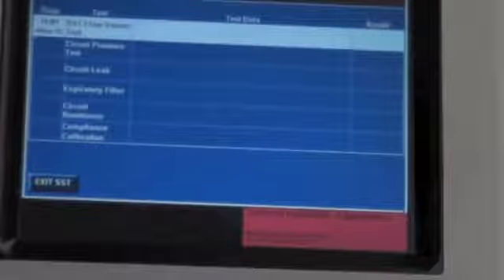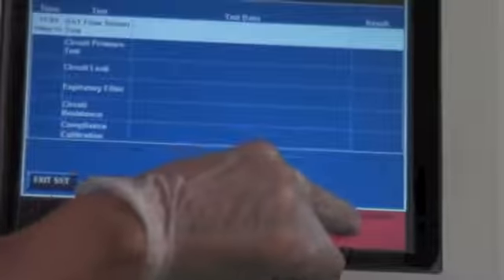If the status of the SST flow sensor test is a failure, you cannot use the override function. You will have to repeat the test. The system checks the accuracy of the inspiratory and expiratory flow sensors. After the test completes, the system prompts you to connect the humidifier if applicable. When done, press the accept key.